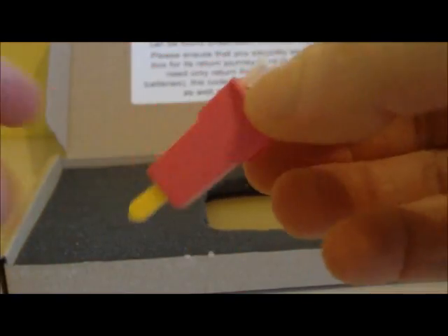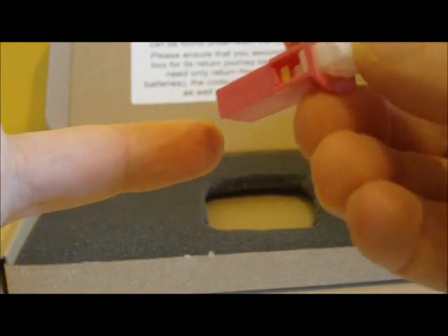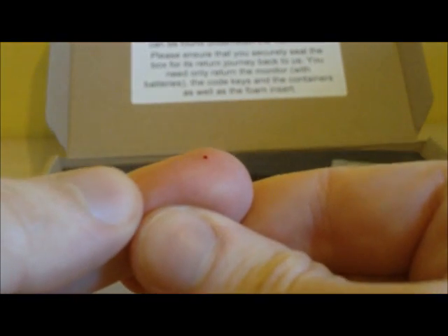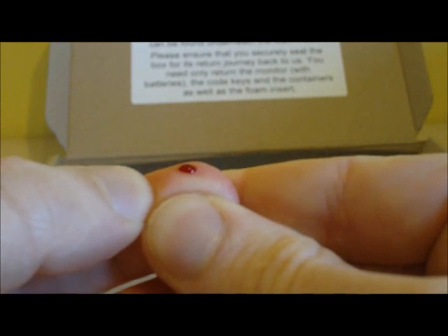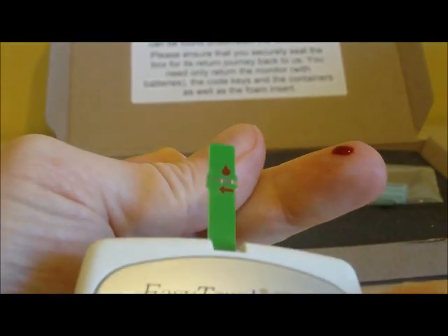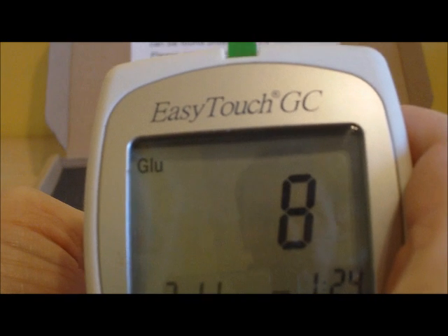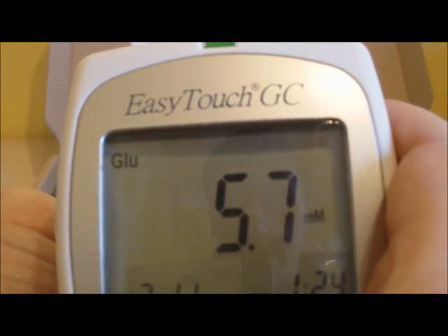Take a lancet and just like before remove the yellow cap. Find a finger, make sure your hands are clean and washed, hold the lancet against the finger, push down on the white top and you will hear a click — your blood sample will start to come. You do not need as large a blood sample as for the cholesterol test. Introduce the blood sample to the indicated side and you will see it soak straight along. It starts counting down and only takes 10 seconds — a lot quicker. The glucose level displayed is 5.7.